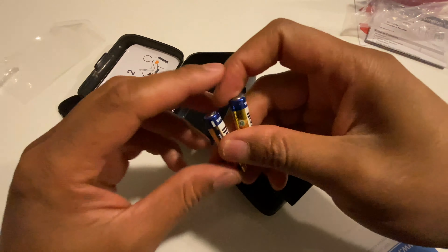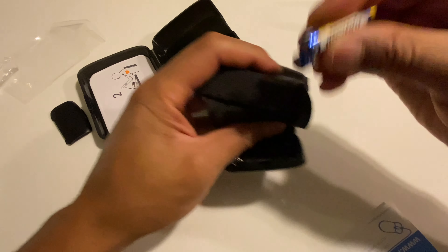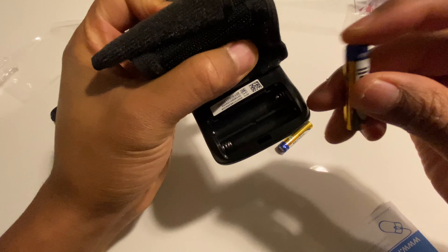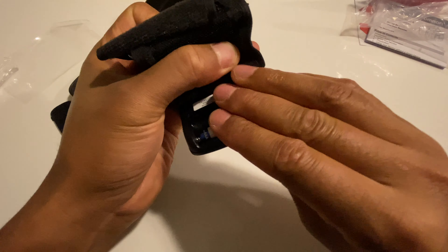I'm going to take the two batteries and remove them from the plastic packaging they came in, and then I'm going to look inside the blood pressure monitor to see which way the batteries are supposed to be lined up.